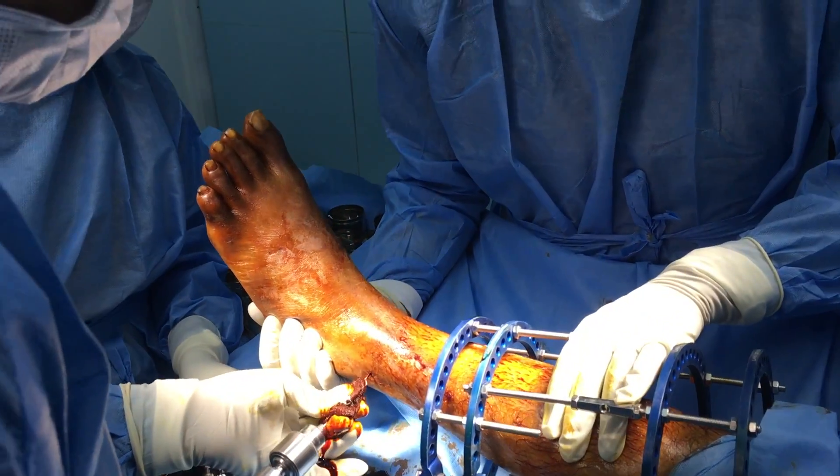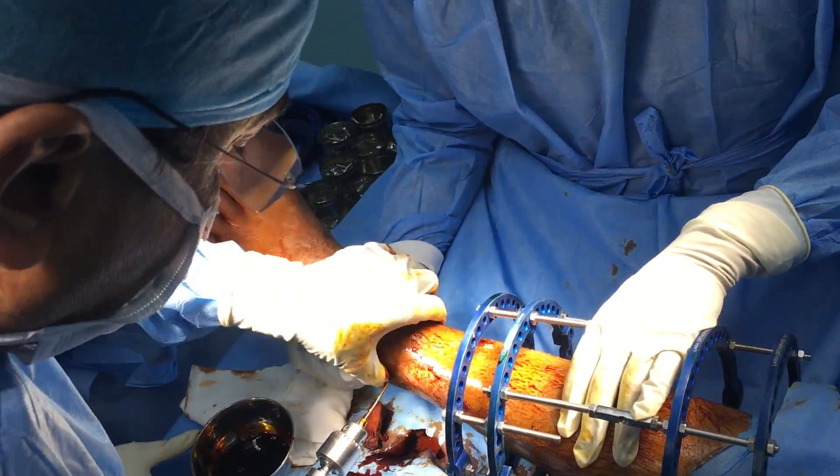This is going to be a non-expansile, non-contractile stable assembly which shall not be disturbed during surgery.